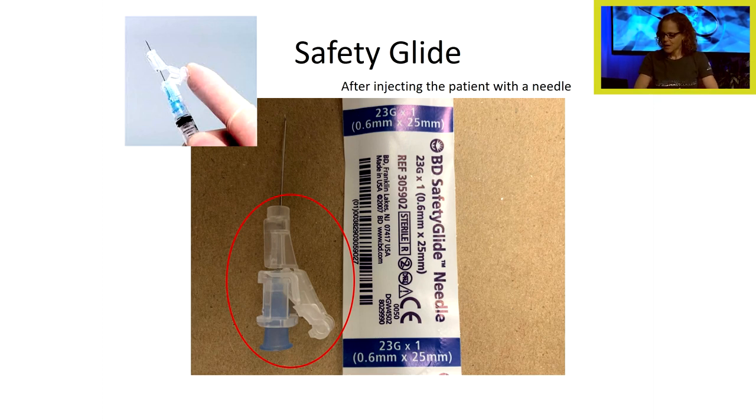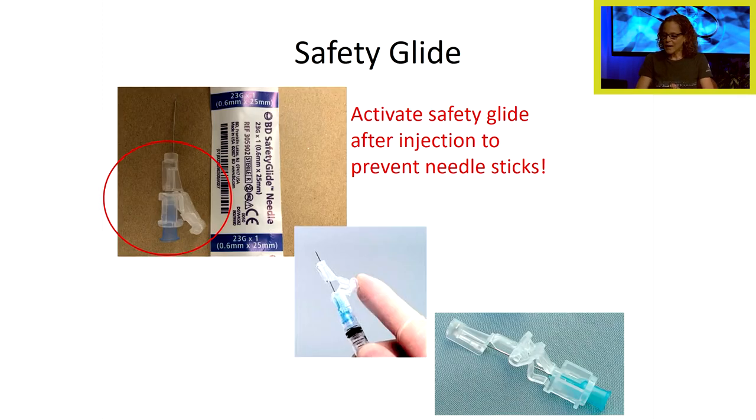Let's talk about the safety glide. After injecting the patient with the needle, we can activate the safety glide with our finger. You can see the safety glide in the position it's in when preparing the med and giving the injection, and the finger sliding the safety glide over the needle after the injection — before throwing the needle into the sharps container. The safety glide is a feature on many needles used nowadays in the clinical setting, including the needles you'll use in lab. We want to activate it after injection to prevent needle sticks.